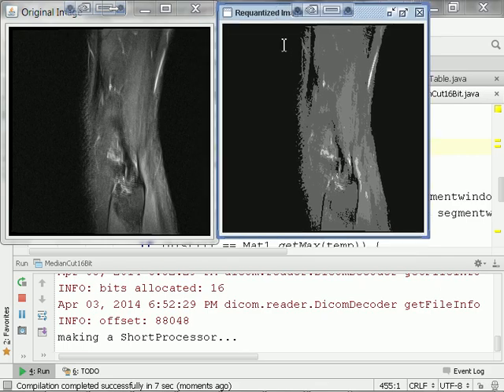That's interesting. Wow. So if I wanted to do a lookup table for 16-bit images, would I be able to do that? Would you be able to do it? You saw the details now for 8-bit images and also color images. Now you want to try and do it on your own with the DICOM image, right? You've seen it happen a couple times now. Here we have the 16-bit values being mapped to 8-bit values. That's legit.